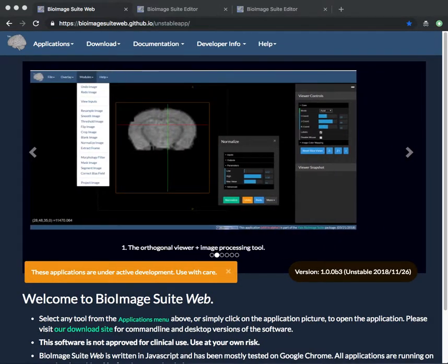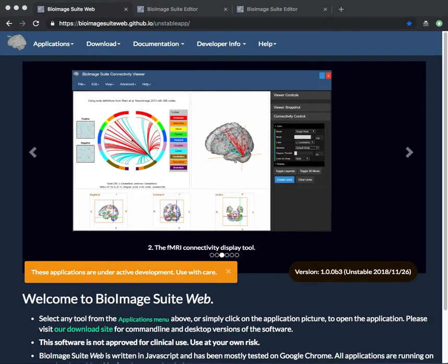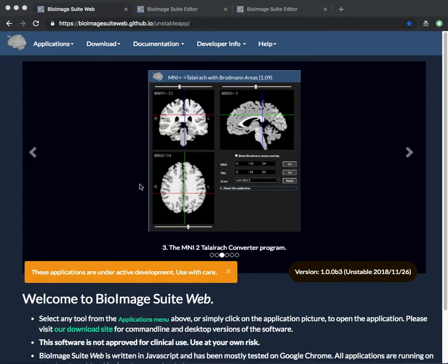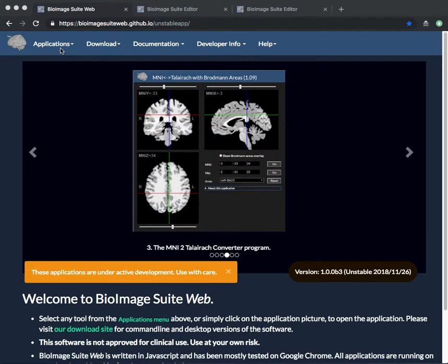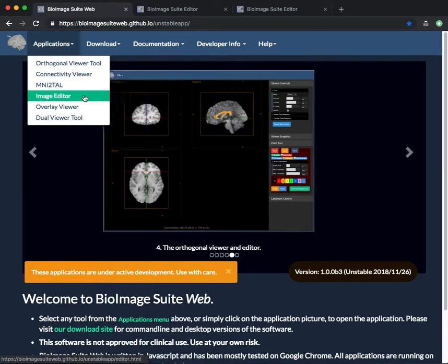This video will give you a brief introduction to the Image Editor application in BioImage Suite and show you how to use the Paint Tool.